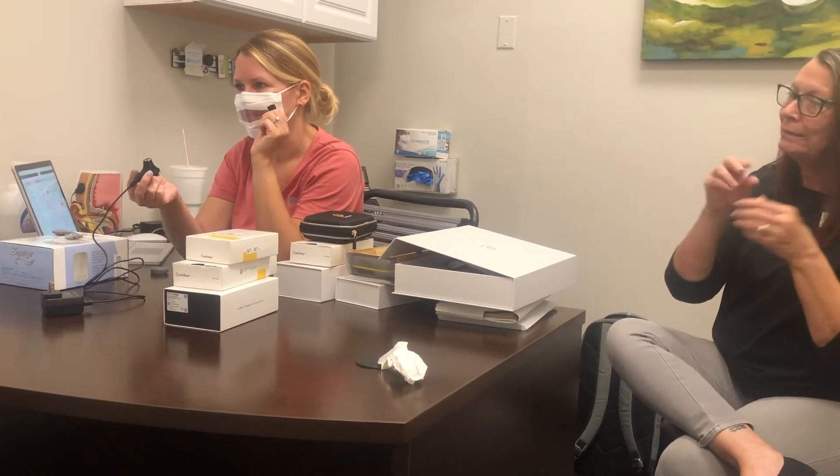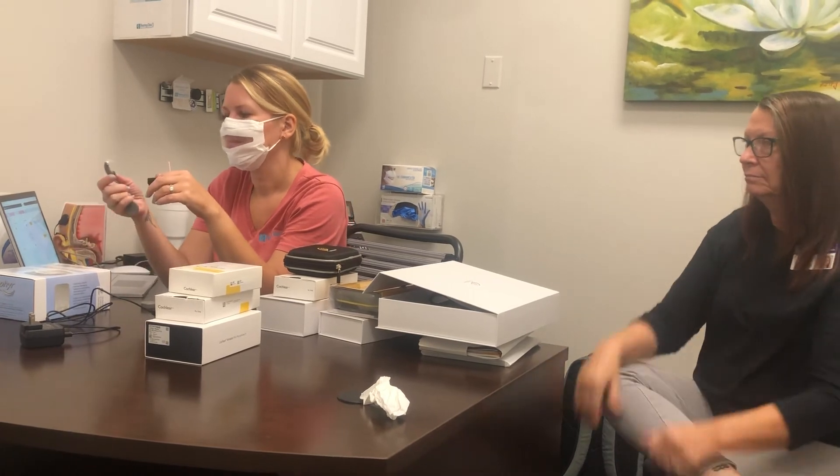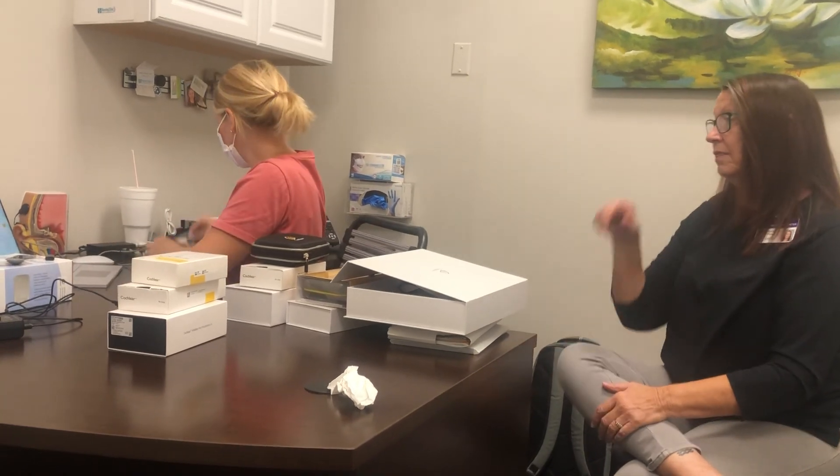In the morning you'll take the battery off, put it on the charger, and get the fresh battery. This process might be a little different if you use the Canso as well, but this is the protocol if you're going to use the Nucleus 7 every day. So: fresh battery every morning, the dryer at night — and you're good.